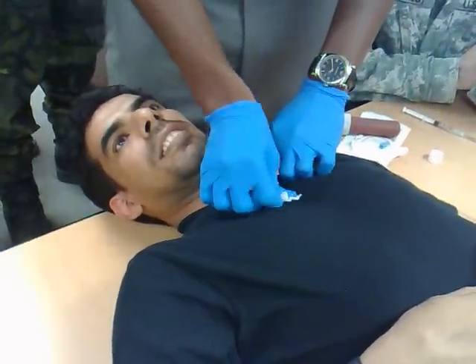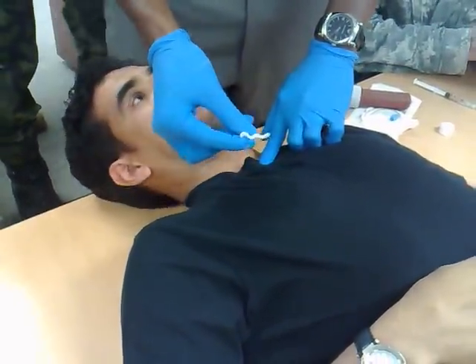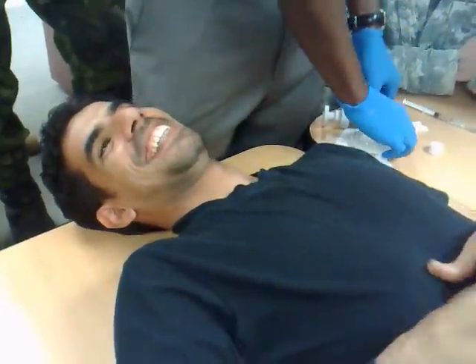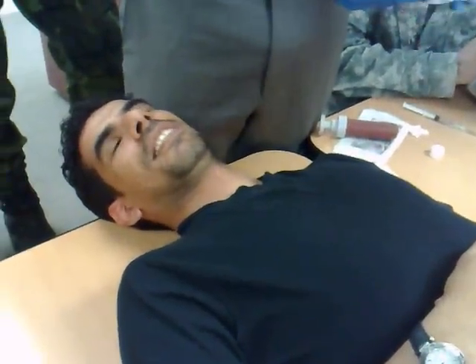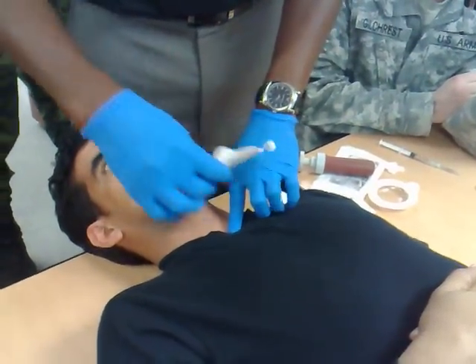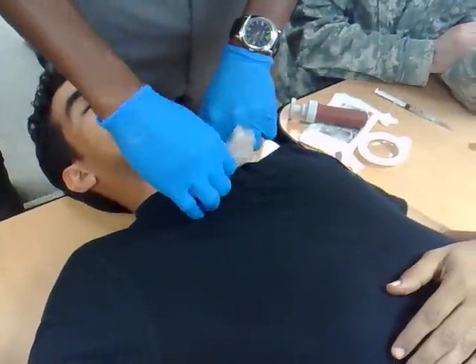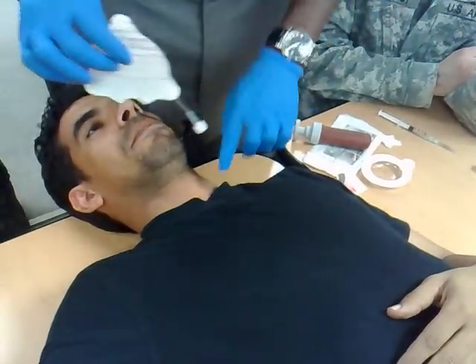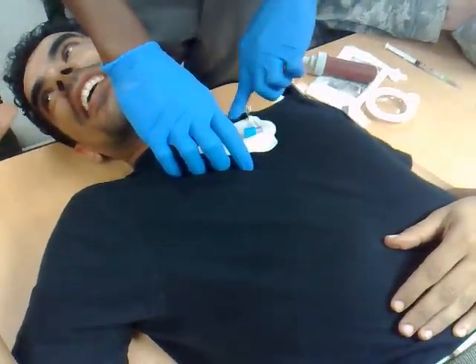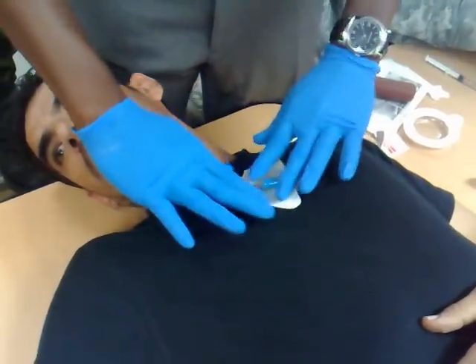When you get into combat, you'll find yourself improvising a lot. Why are you dabbing this shirt if you can just go right on there? Because I don't want to expose them — I can't expose them in class. We're gonna use somebody else. You're gonna take the patch — the target patch — right where you cleansed. Make sure you find the suprasternal notch once again. See that cutout in the patch? Go ahead and place it directly against your finger. Remove the first adhesive piece of tape. Place it directly against your finger — no way to change your mind once this is placed. Go ahead and recheck, making sure you're in the correct spot.